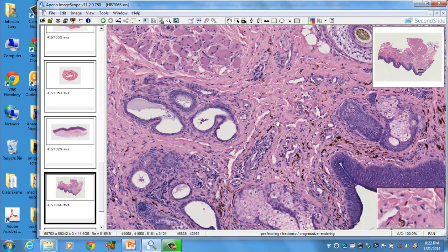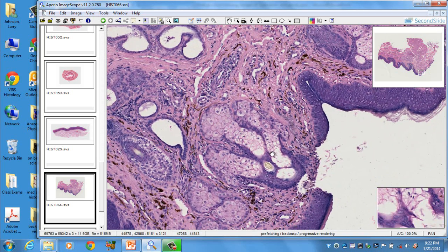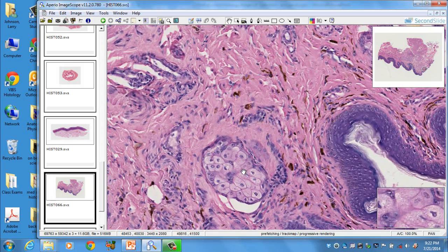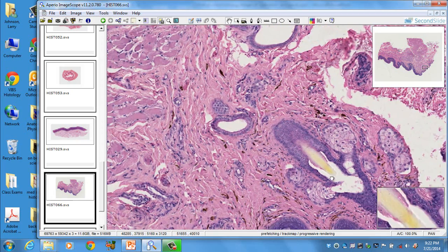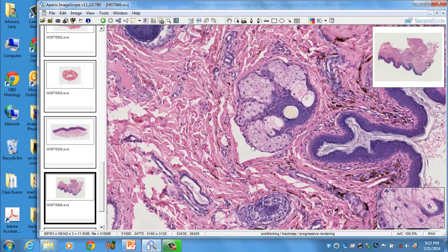And here we can see the apocrine sweat glands that discharge. You can see they're discharging here into the hair follicle, and here we can see the sebaceous gland discharging into the hair follicle. Here's a hair shaft right here. These are the apocrine sweat glands that discharge into there. This is the sebaceous gland. Sebaceous gland, remember, has the holocrine secretion that secretes in there. Here you can see the sebaceous gland empty out into a hair follicle. More apocrine sweat glands in through there, more sebaceous glands.